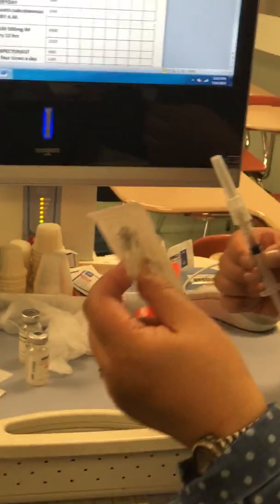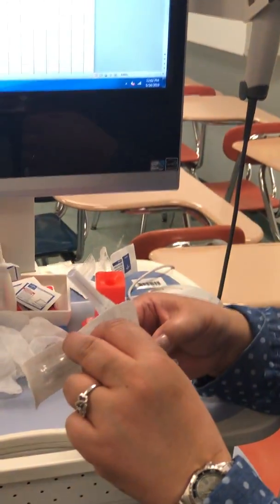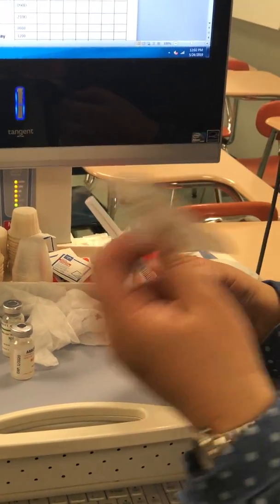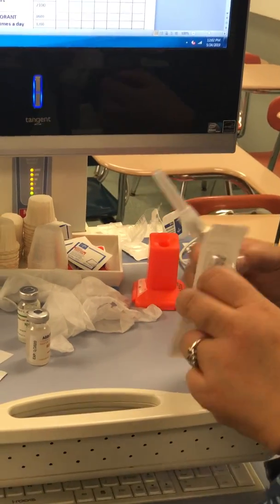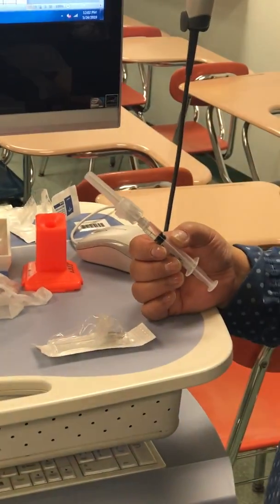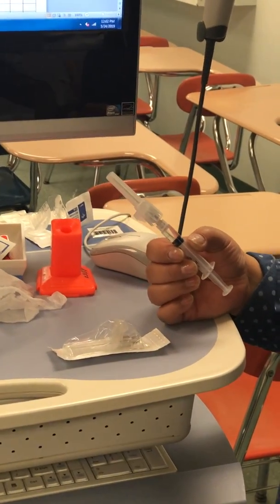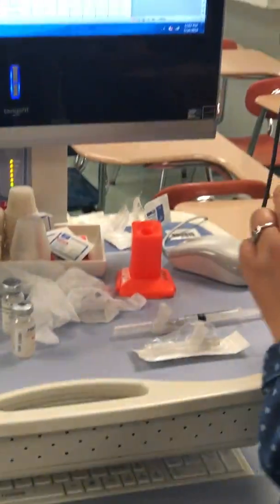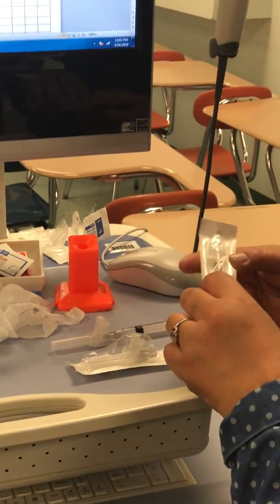All right, so I'll put this over here, because I need this for my... I will verbalize. I will change the needle to prevent irritation to the muscle layers. Just verbalize it. Don't do it for real because we're not going to a real patient. We're going to the cheesecake. I'm sorry, the injector pad. All right.